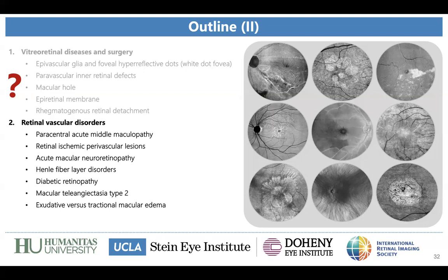I think the same can be done with macular holes to actually study, for example, the extent of photoreceptors recovery in a certain percentage of the hole, and so I think this is a very important application, and we are not studying that, but a very important application.